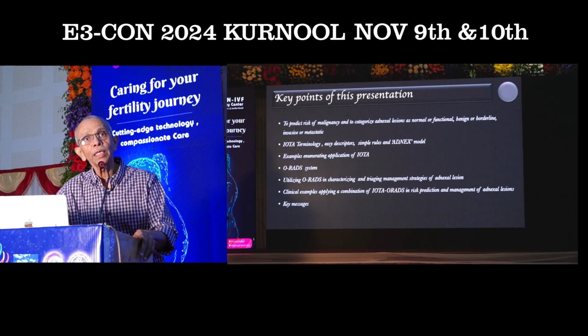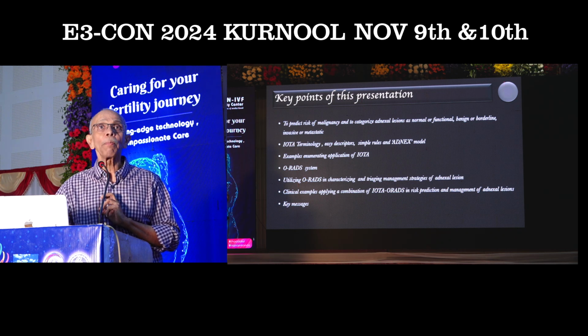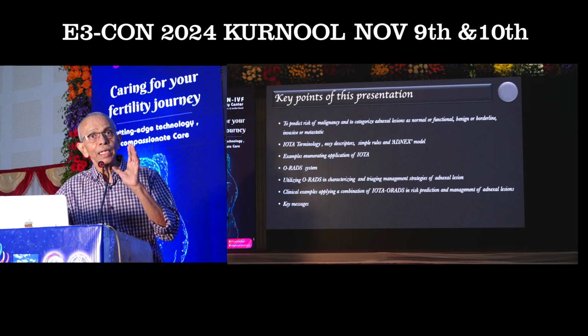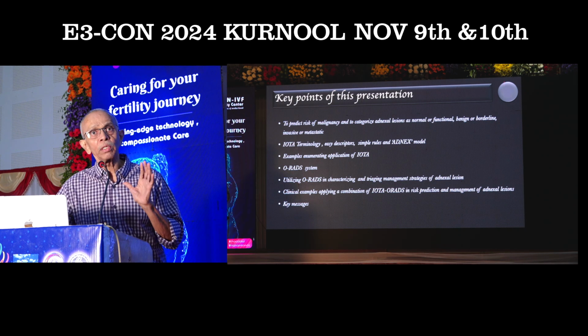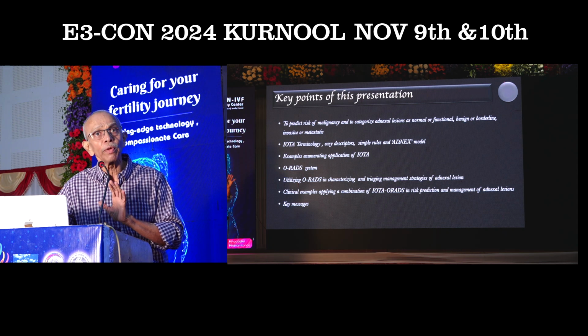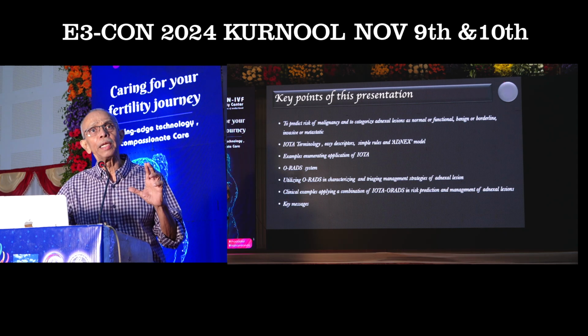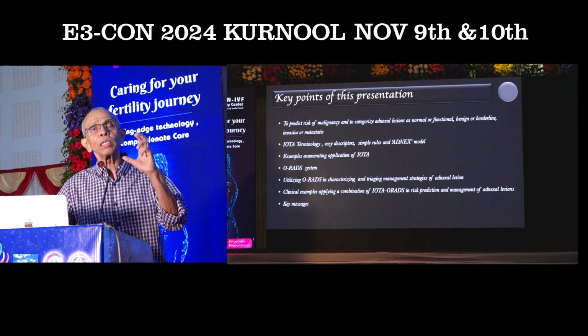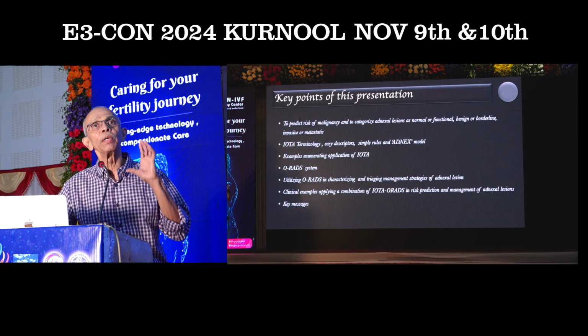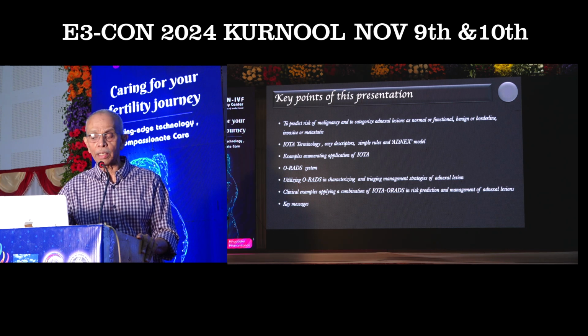Second most important thing is they have formulated what are called the easy descriptors or pattern recognitions. There are certain adnexal lesions where, by just looking at them, you can give a diagnosis. You don't even need to give a differential diagnosis. There is no need for histopathology. Those are certain lesions whose morphological features are highly suggestive of a particular lesion. That is what is called the easy descriptors or pattern recognition.